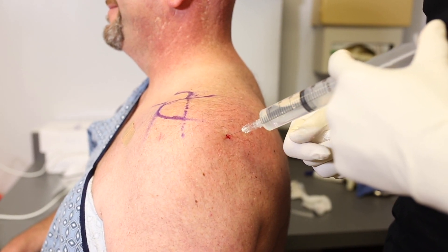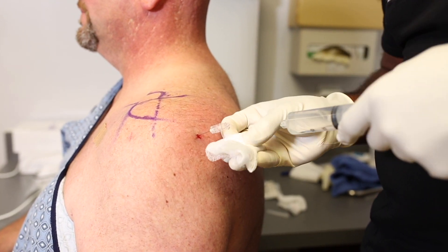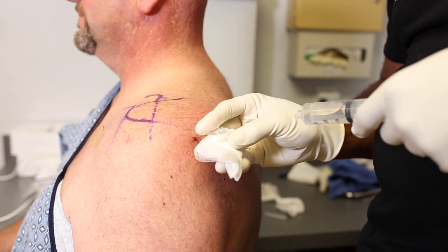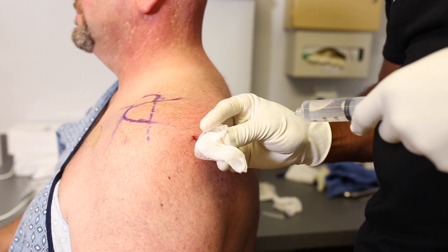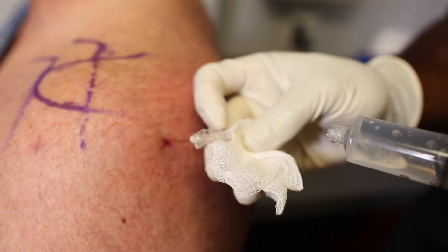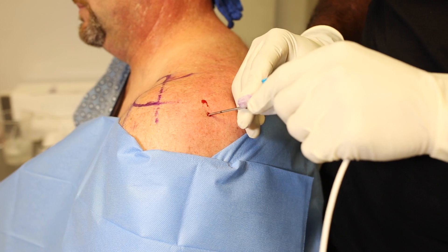Here we are injecting a little bit of normal saline, and as we get into the soft tissues we can inject a little bit of local anesthetic like lidocaine. If we need further confirmation that we're in the joint, we can inject normal saline and watch the back pressure push the fluid back out through the spinal needle, providing additional confirmation of intra-articular placement.